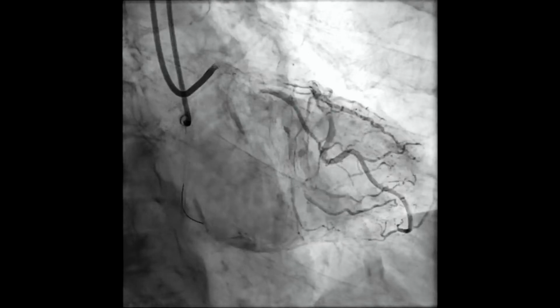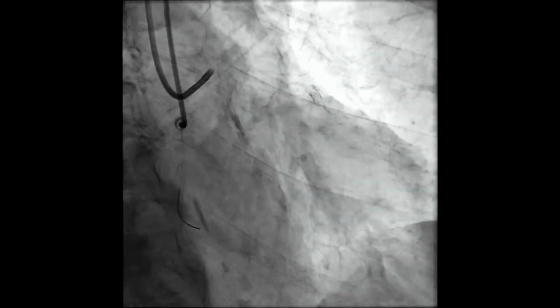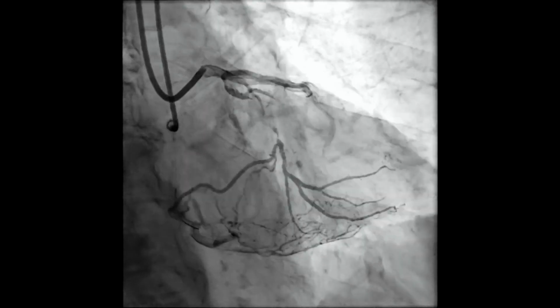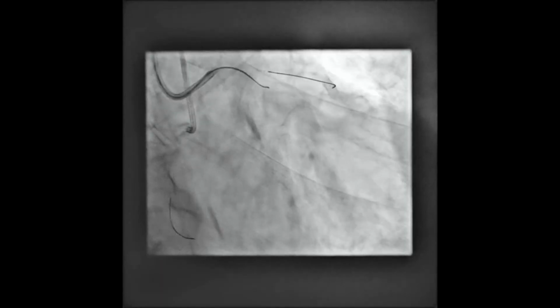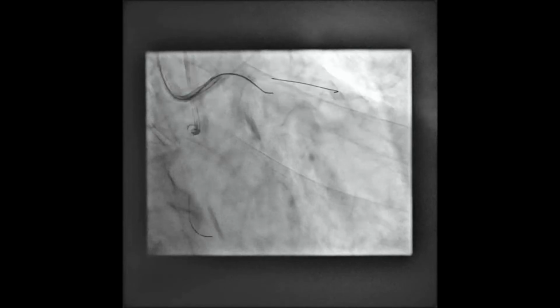So on looking at this angiogram, it looked like a relatively long segment, pretty minimal calcium, pretty straight, surprisingly, for a circumflex. So we planned an antegrade first option. There are some epicardial options if needed. So we got started with a Turnpike and workhorse wire to make sure that we were on the proximal cap, and then started working on the antegrade wiring of the vessel.